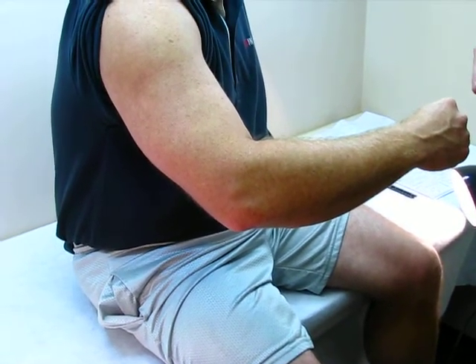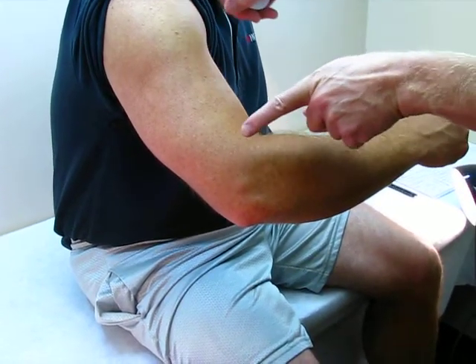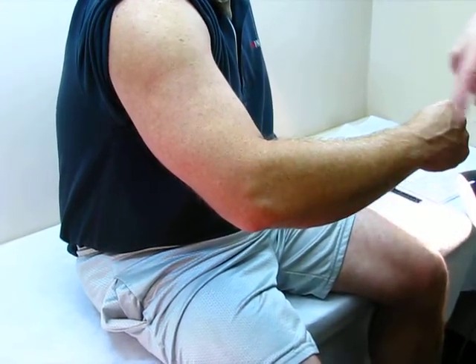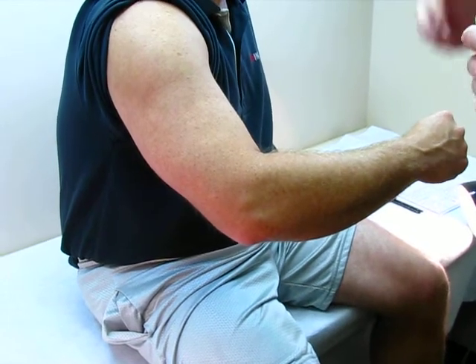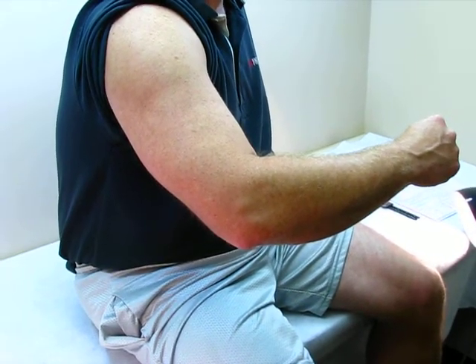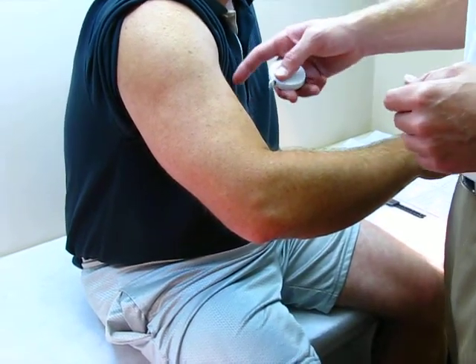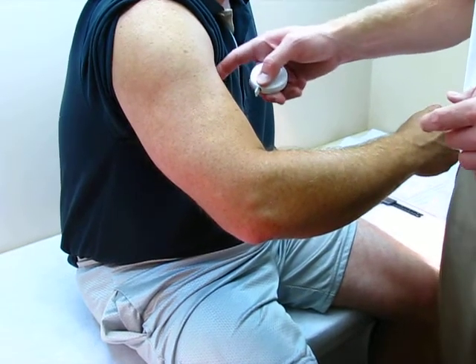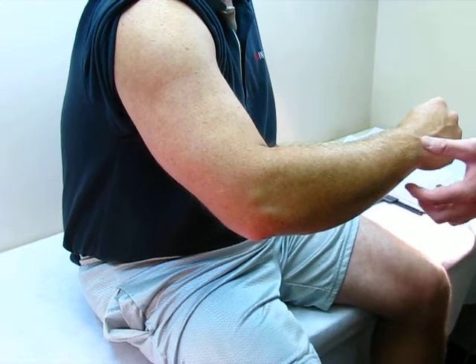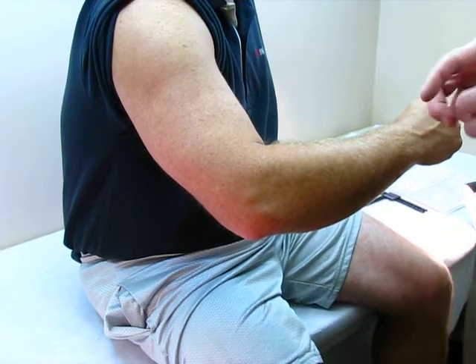Because this brace is a custom brace, you will need to specify how long you want your frame arms proximally and distally. If there is no length specification, Ortho Innovations will just standard make them seven inches. We want to make sure that the brace is long enough so it doesn't impinge in the axilla, and distally on the forearm, we want it long enough so it won't impinge when the patient flexes or extends the wrist.